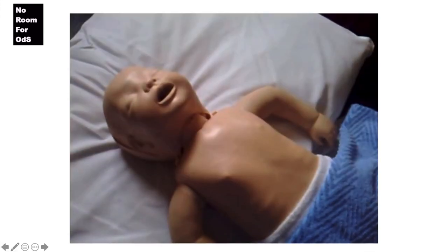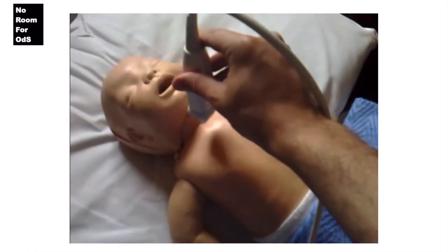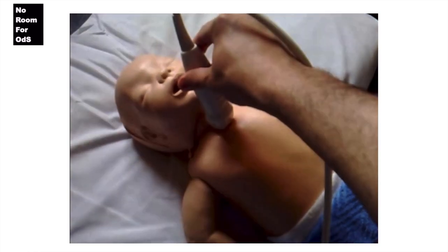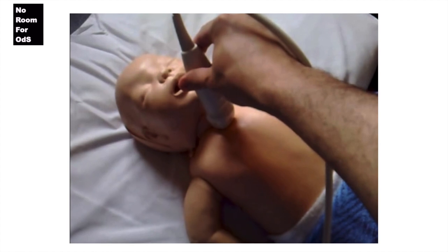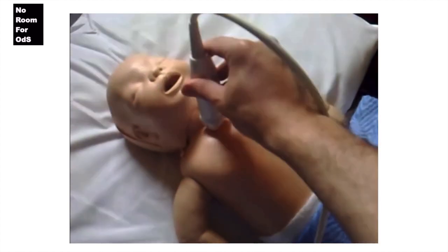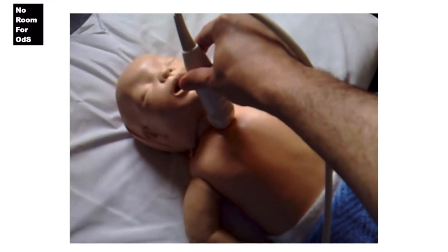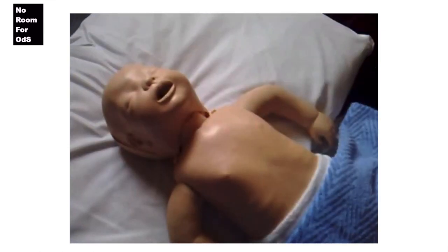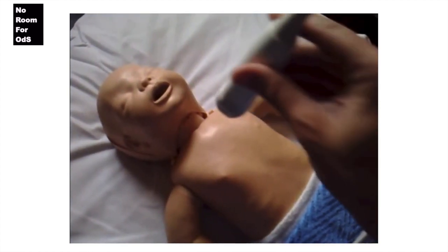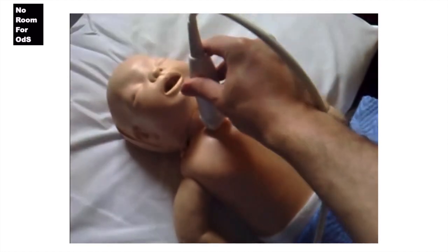How to get this view? You put the probe in the suprasternal area with the marker to the left, and there is no specific landmark to be honest. Basically, you just go to the suprasternal area and look towards where the LA is. You may need to do, of course, a little bit of tilting, a little bit of rotation or derotation.